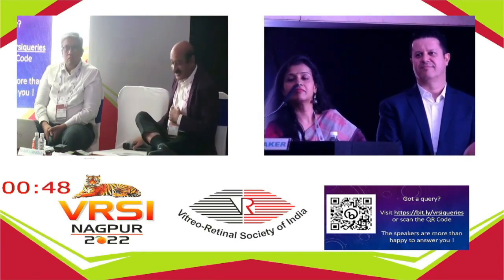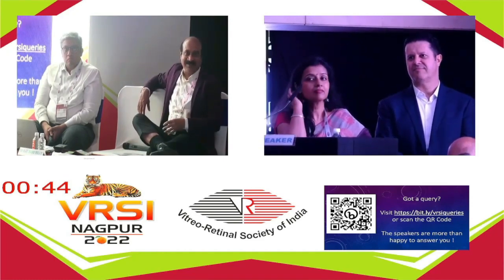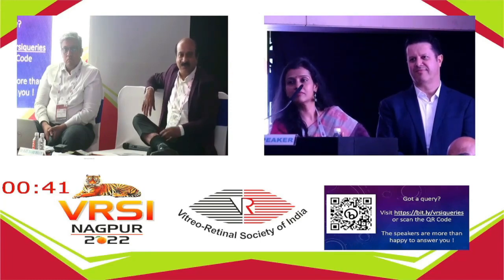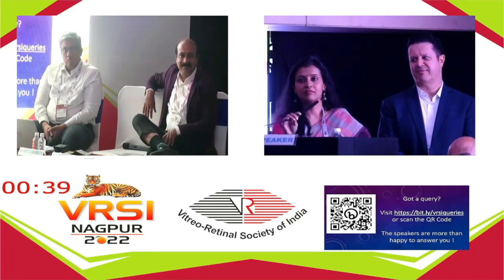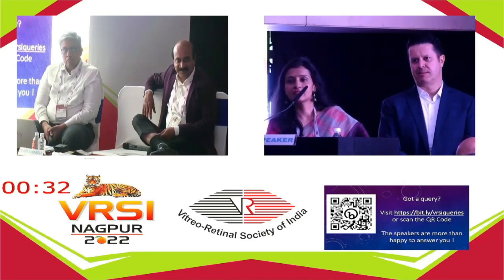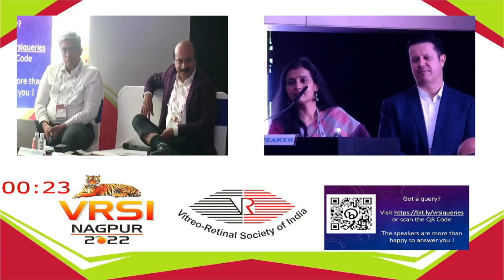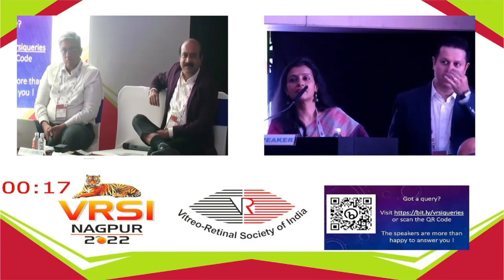I just wanted to add one thing. First of all, the terminology true color is mostly a marketing thing from the different companies. There is the color that we perceive using our slit lamp systems when we examine the patient. Many of us think true color is something that faithfully reflects what I see when I examine the patient, and the photograph I obtain does something similar. Traditional fundus cameras have probably done the best job of replicating that. All of these other systems have various differences and advantages.